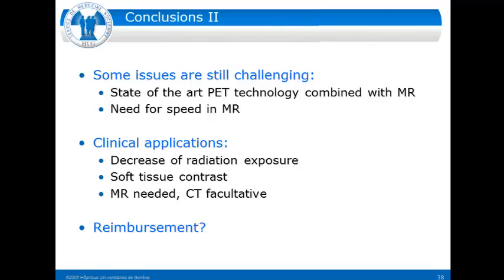And on the other hand, a question which is not resolved, I think, everywhere where PET-MR is used: how are the costs developing, and how can PET-MR be reimbursed in the future?